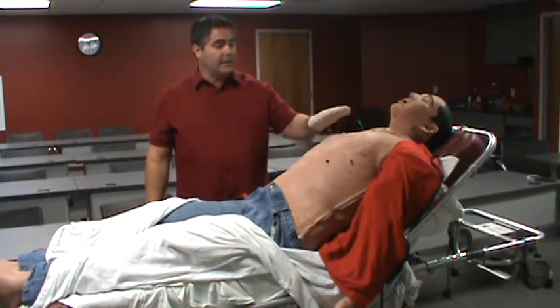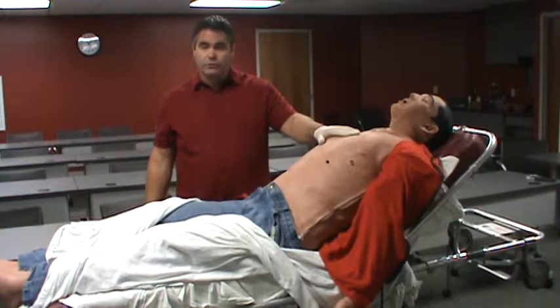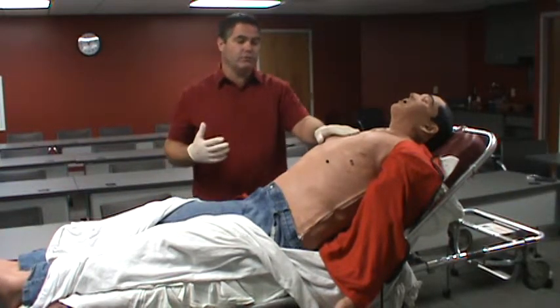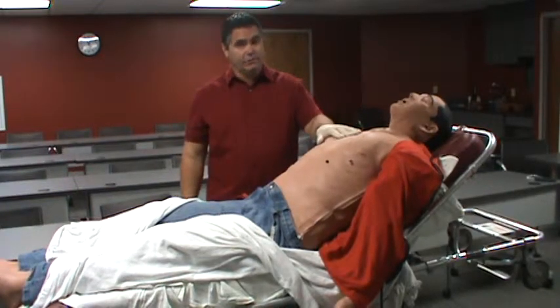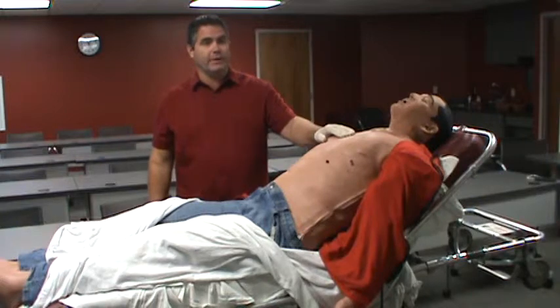He can get chest compressions at 2 inches, so when we go through simulation, we want you to push for those 2-plus inches. He is not allowed to have a Lucas on him — that's the one drawback there.